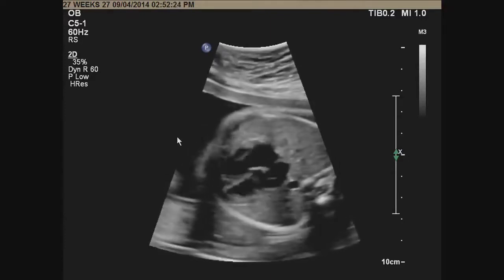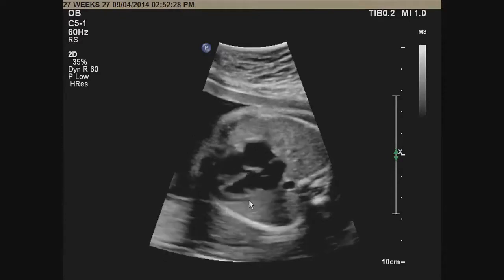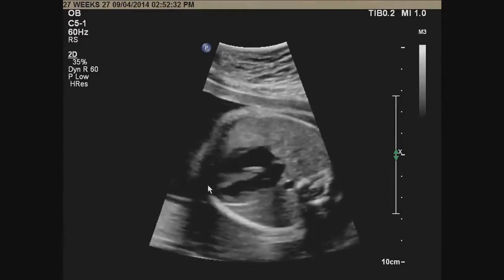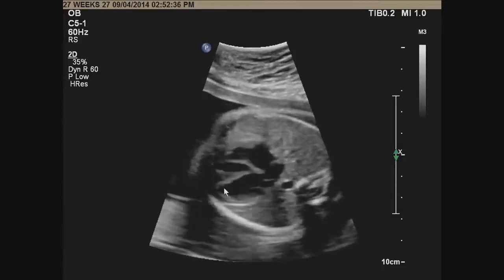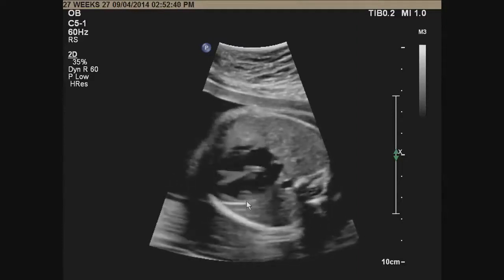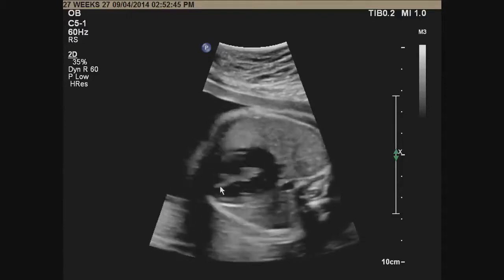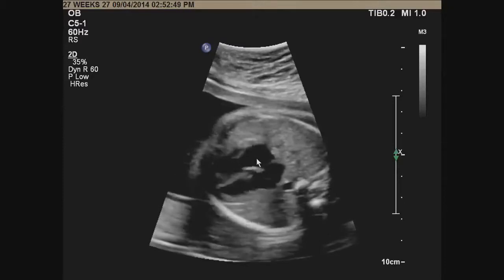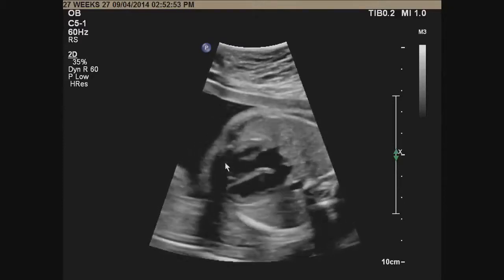Here this allows me to evaluate the ventricles. So I can look at the contractility. This is the left ventricle right here. Look at the apex. It forms the apex of the heart, nice and smooth on the inside, described as bullet-shaped. And you see the contractility is nice and equal. I also look at the septum to make sure there's no abnormal contractility of the septum. So the septum is moving nicely between the two. Then I'm going to look at the right ventricle here. See that the border is more coarse.